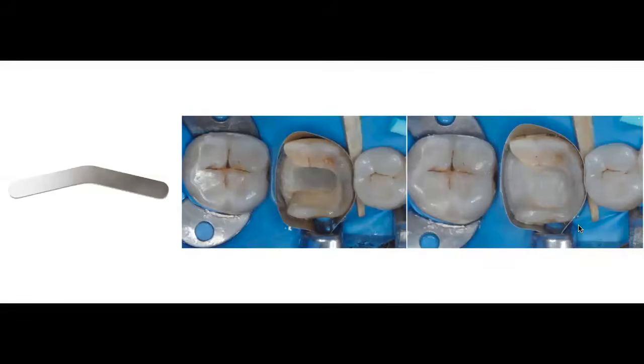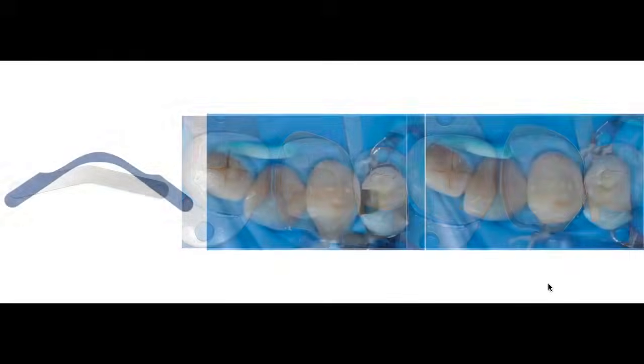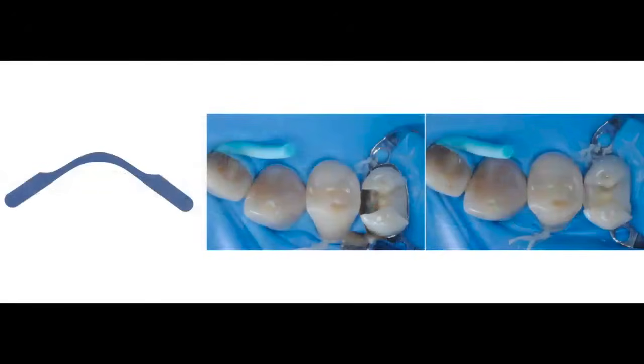So you may be able to get away with using a regular Tofflemire band in some of your cases, but definitely it's not a band that you're going to be able to use repeatedly or in multiple different clinical scenarios. So for that reason, some years back, a band was created, which is a deep margin elevation Tofflemire band.